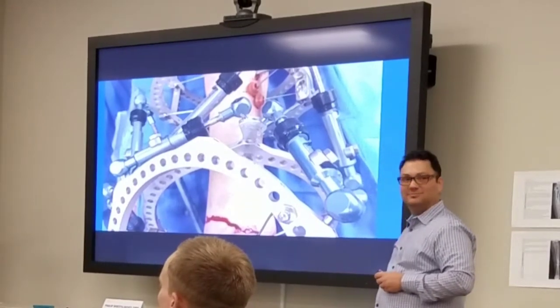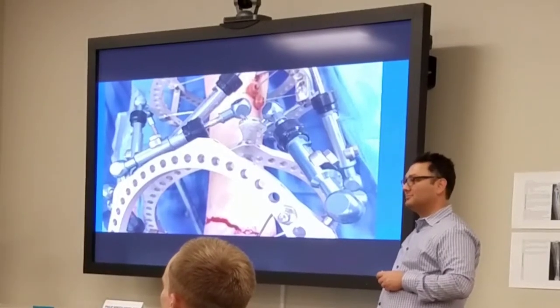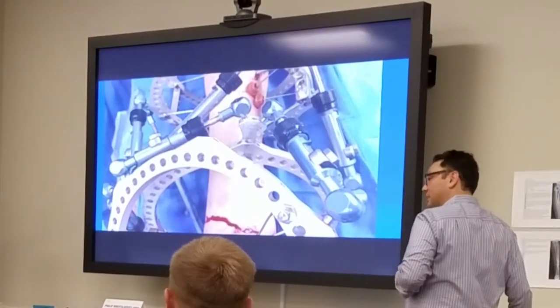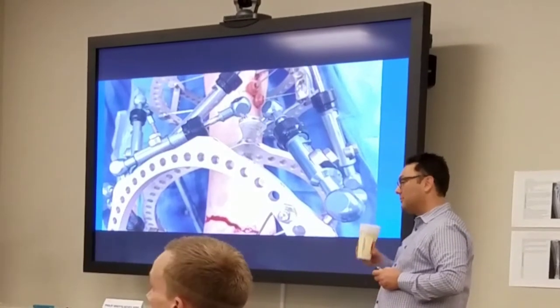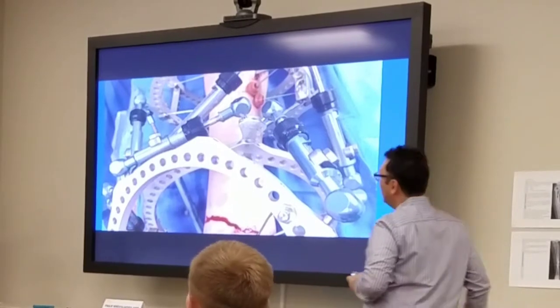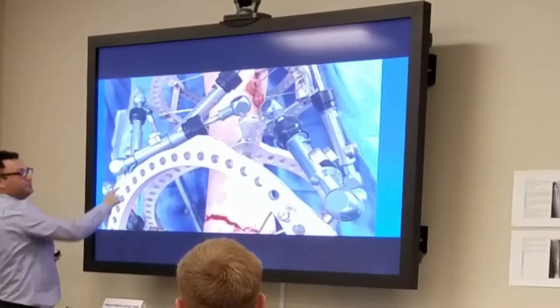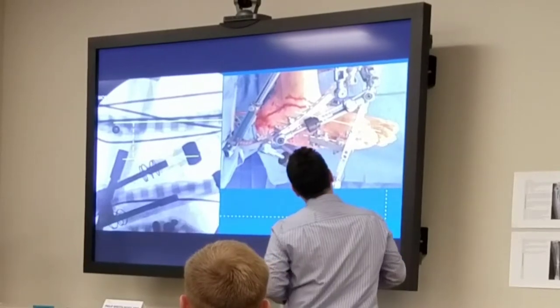The only thing you can see in the software is a warning that whatever construct you're using is physically impossible. Do you want to continue? And you say, yes, I'm continuing. If you use emergency tabs, you may get that warning, but you continue, as it's no emergency tab to the software. I used the emergency tab in this case because this strut was hitting against the ring over there. I'll show you some other examples so you can know when to use the emergency tab.